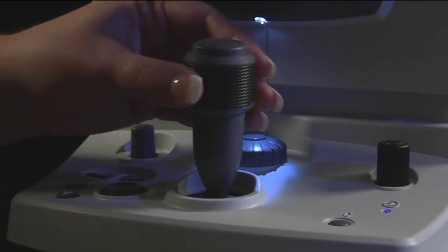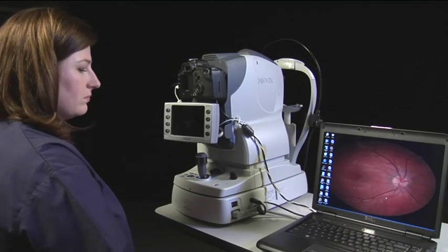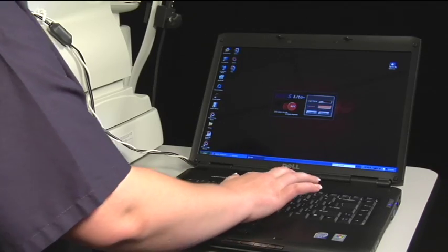Move the joystick or press a button to resume using the AFC. Even though the screen is not active, the computer will always be on. Remember that the computer does not have a screensaver and one should not be installed.